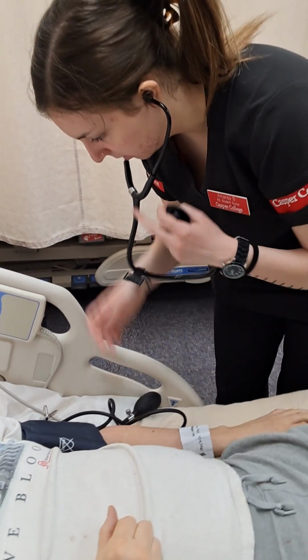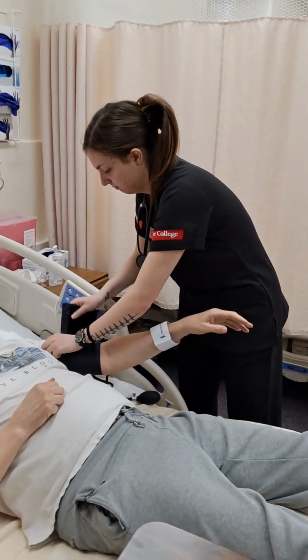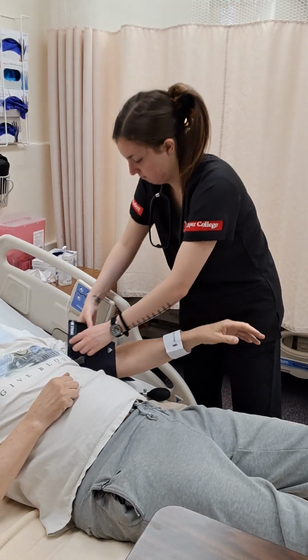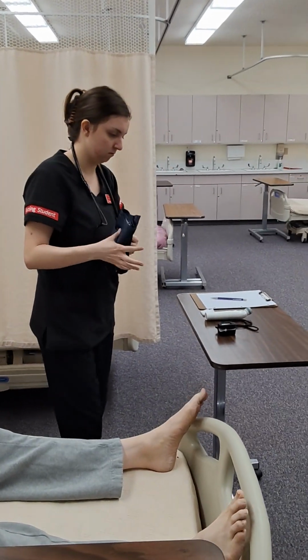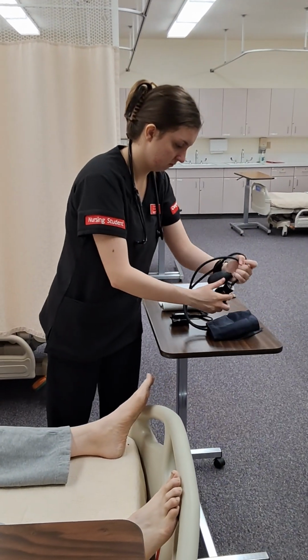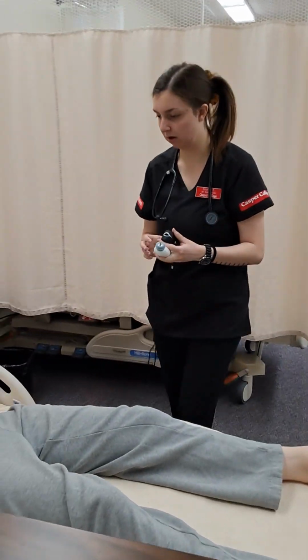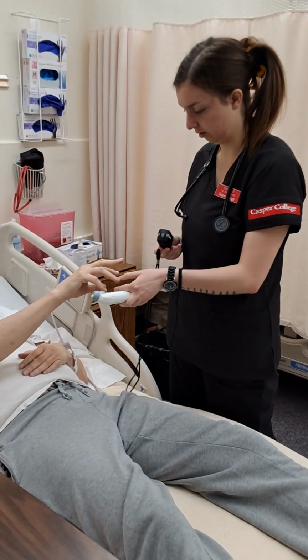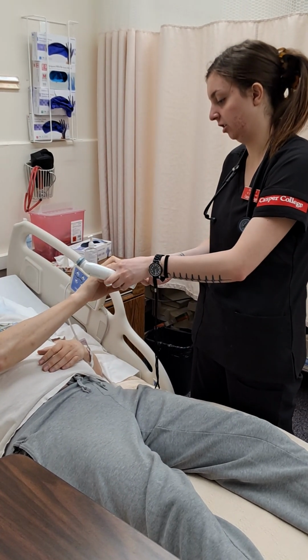Okay, his blood pressure was 110/60. Okay, I'm going to put this pulse oximeter on you. It just measures your oxygen saturation and your pulse.